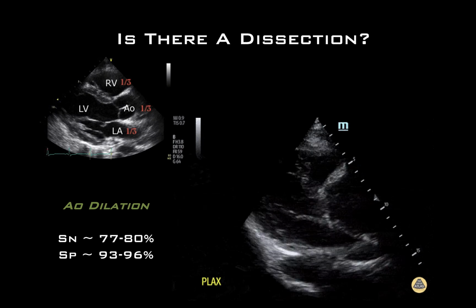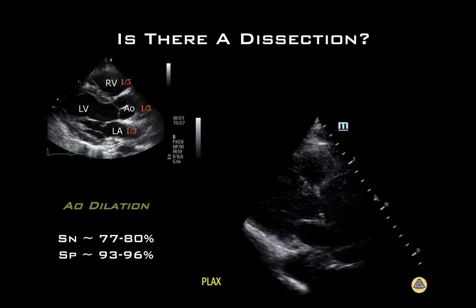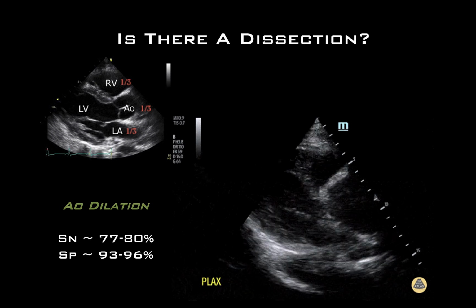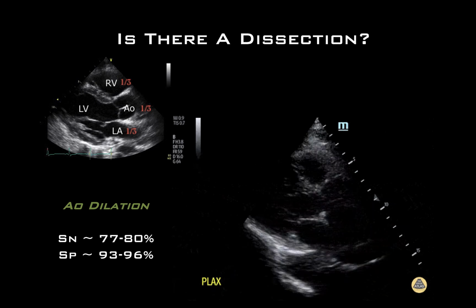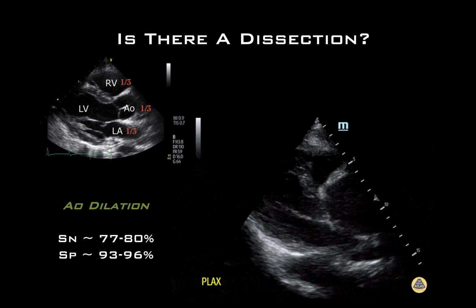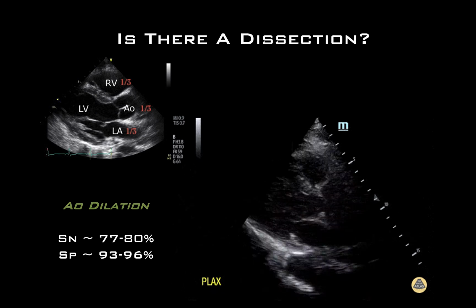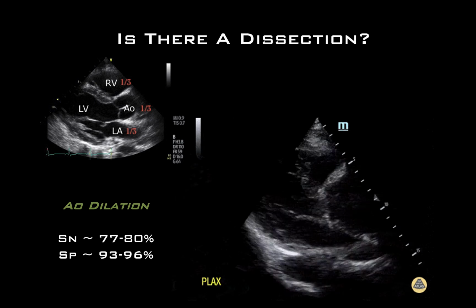Screening for a thoracic aortic dissection may be more difficult and poorly sensitive, but findings are helpful if they are positive. During cardiac views, attempt to freeze your image during parasternal long axis view, and remember the rule of thirds. The RV, aortic root, and the LA should look roughly equal. If the aortic root is large, that is suggestive of a possibly aneurysmal aorta. In this case, the aortic root is enlarged. A type A dissection was confirmed on subsequent CT or aortogram.